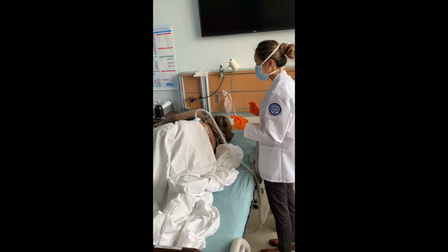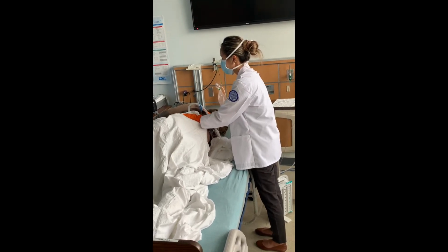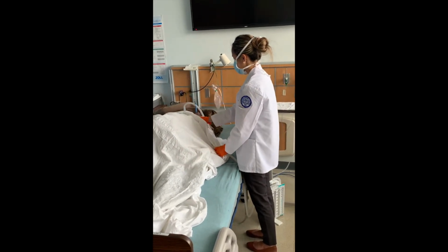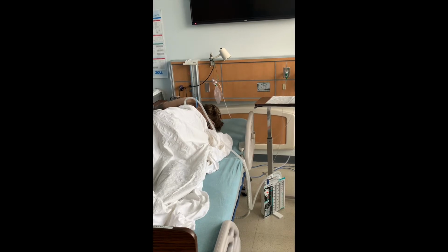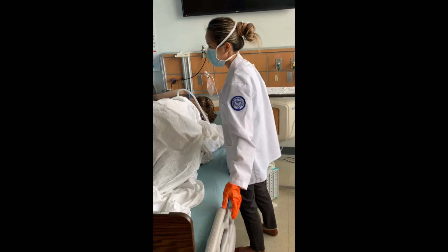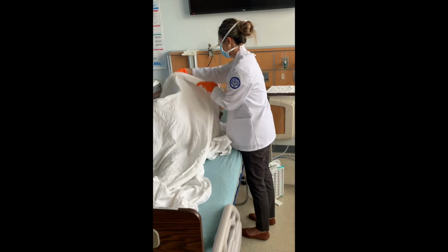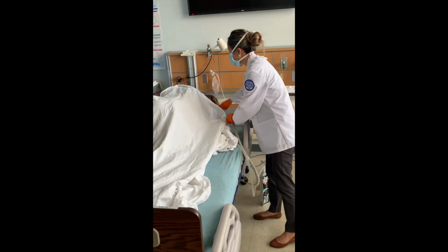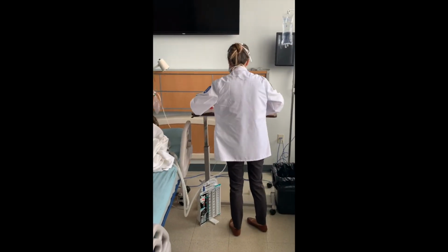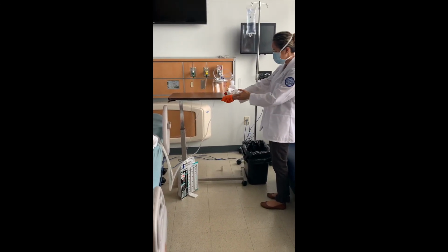Have the patient turn, cough, and deep breathe. This should help loosen secretions. Make sure after you've adjusted the suction according to the provider's instructions that the bed is in the low and locked position, 3 out of 4 rails are up, the patient is comfortable, and the call light is within reach. Dispose of any supplies. Perform hand hygiene and document the procedure and the patient's response.